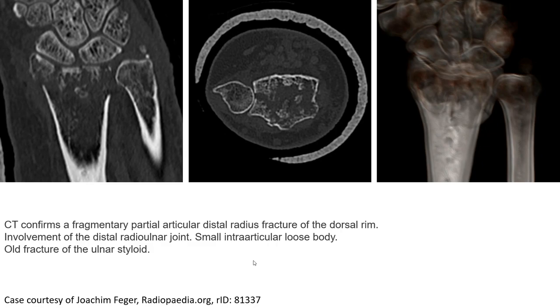This is another example of a Barton fracture on CT, where CT confirms a fragmentary partial articular distal radius fracture with dorsal rim involvement, involvement of the distal radioulnar joint, a small intra-articular loose body, and an associated ulnar styloid fracture.